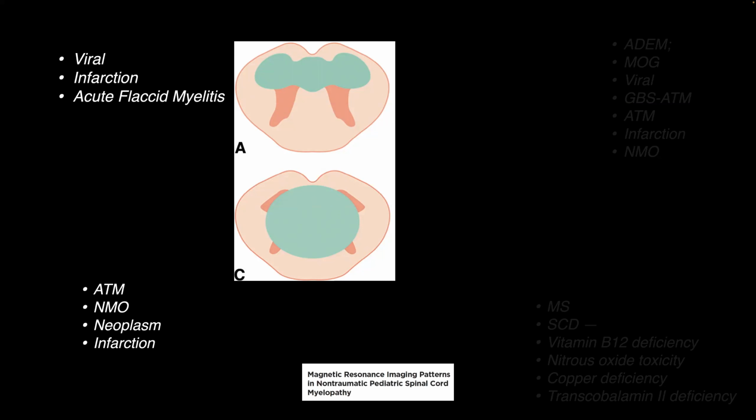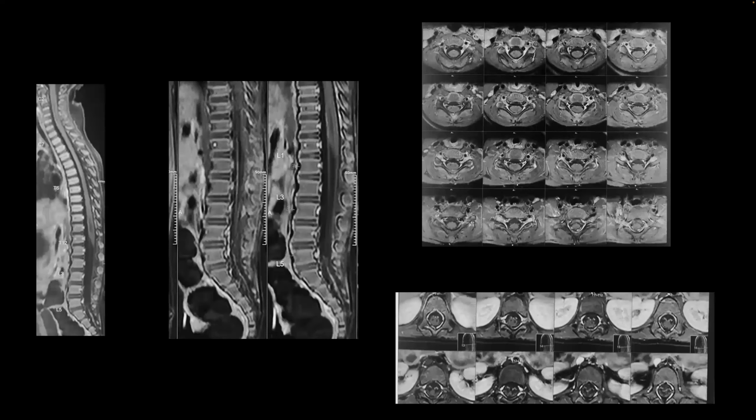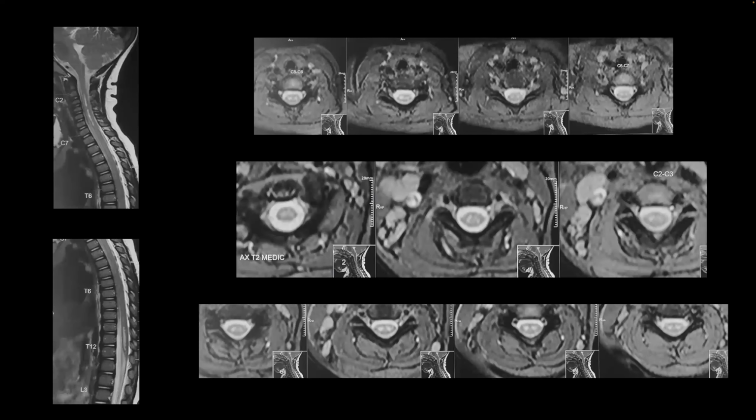So these are the images we have and the clinical presentation, and I wrote in the case. There was no severe pain reported at the time of the weakness, at least. So the main question was the extensive involvement of the neuroaxis, brainstem as well as spinal cord. We were thinking, it could be just acute flaccid myelitis, in that spectrum, or do we work up for demyelinating etiologies?